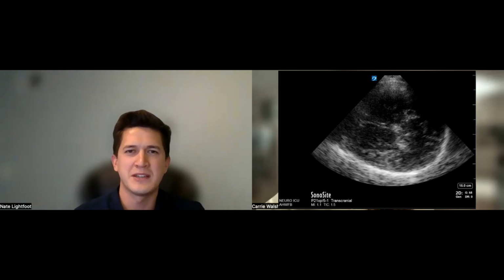That's incredible. I can imagine it would be very useful in the trauma bay where the patient's too unstable to get to CT, just having some kind of idea what's going on. So, is your research in this as well? Yeah, so we're doing research into that. Basically, we were ultrasounding patients in the emergency department who came with stroke-like symptoms, and several of them did have hemorrhagic stroke, and some didn't. So we're actually able to catch a wide variety of brain pathology. But most reliably, we were able to find hemorrhagic strokes.